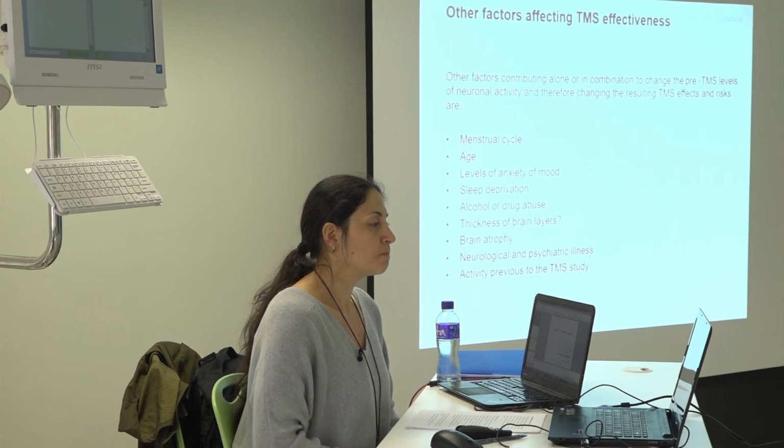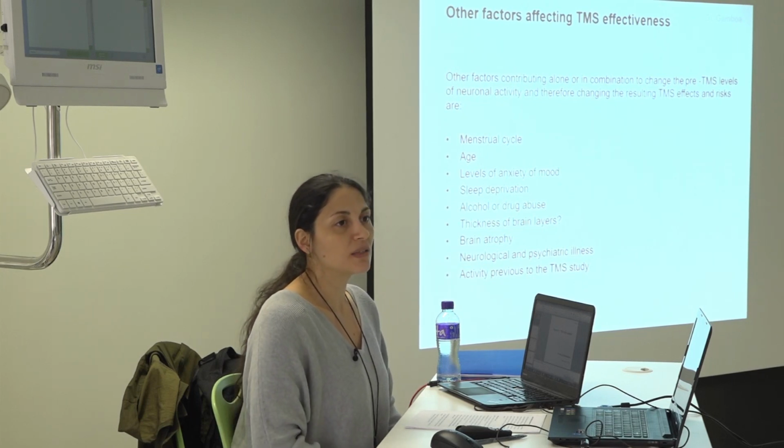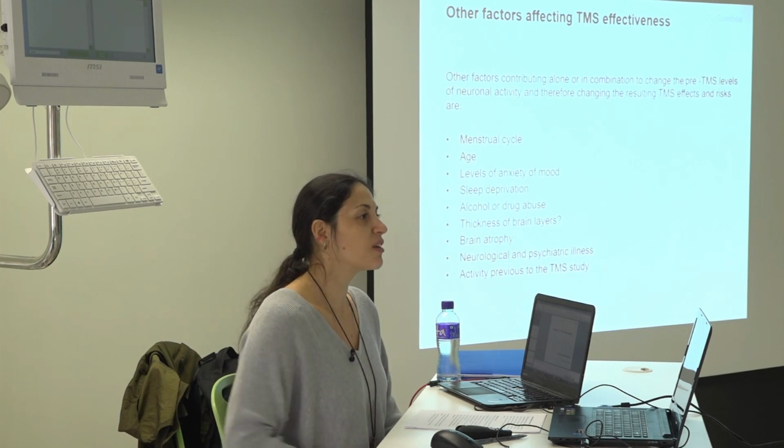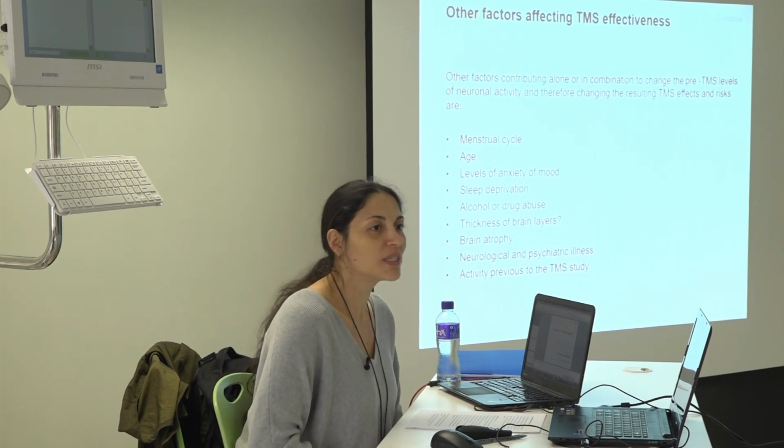And if they have done previously TMS studies, what has happened, what they did. When you are working with, we call it professionals, when you are working with professional people that have done TMS more times, it's kind of pleasant because they know how it is, it's kind of easy. Yes, so it's good to know. Dosing.